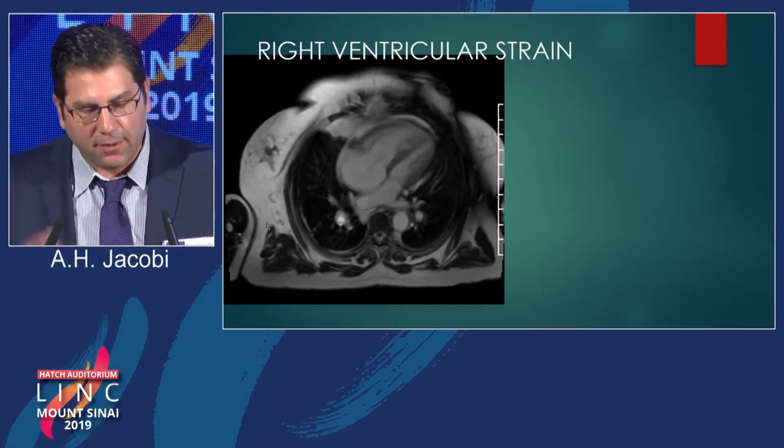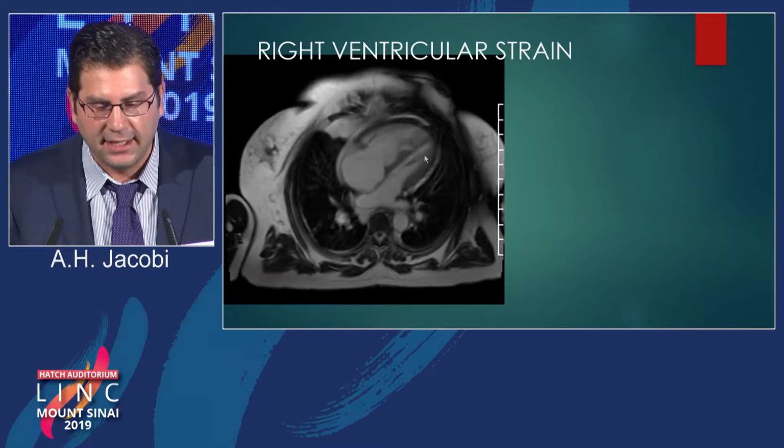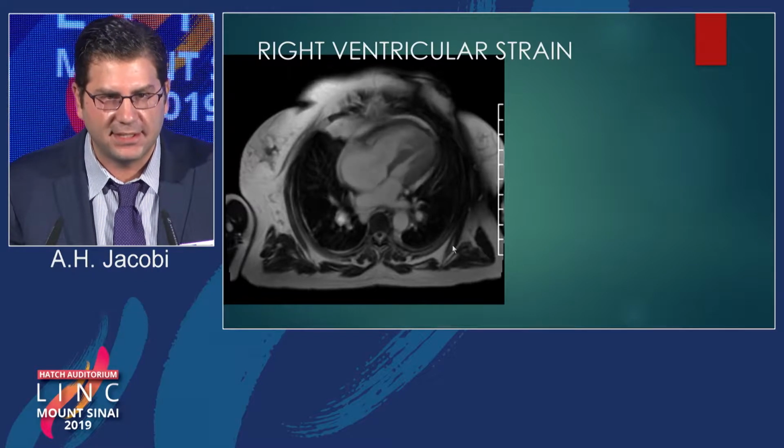So when we talk about right heart strain, I wanted to show you a movie of what it looks like. So this is a cardiac MRI, and basically what you're trying to catch in the CT exam is this in 1 second, so a still image of this.